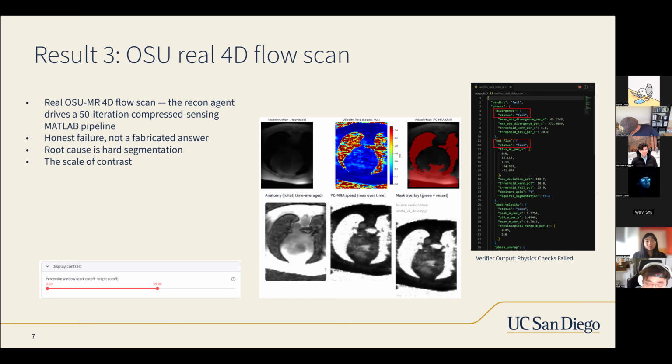Instead, the LLM shouldn't just redraw the ROI and threshold; it should retry with different comparisons of contrast or try some new segmentation models. That's in our future work.